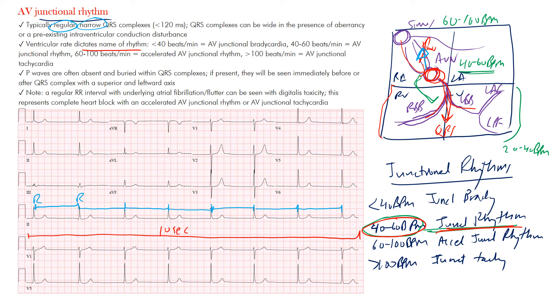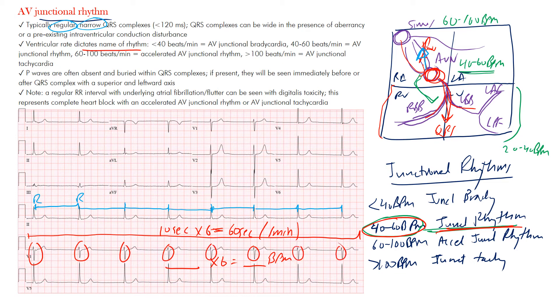To find the rate, remember that a standard 12-lead EKG is 10 seconds. Multiplying by six gives 60 seconds — one minute. Count the complexes across the strip and multiply by six. Here we count one, two, three, four, five, six, seven, eight — so eight times six equals 48 bpm. That falls within the 40–60 bpm range, confirming this is an AV junctional rhythm.